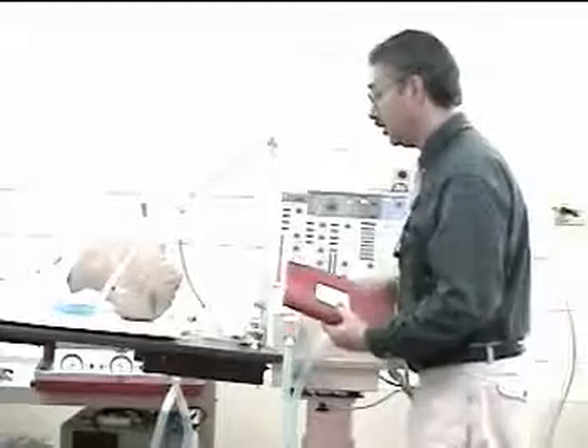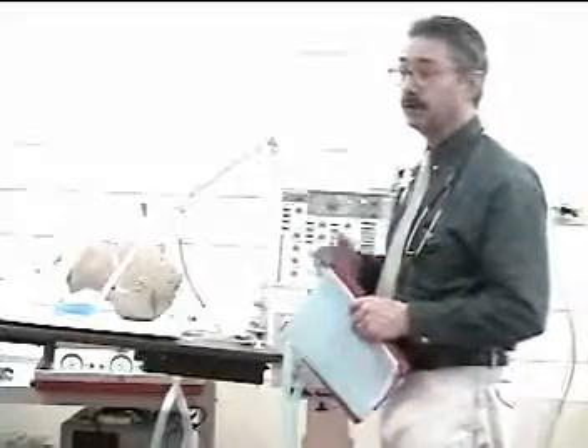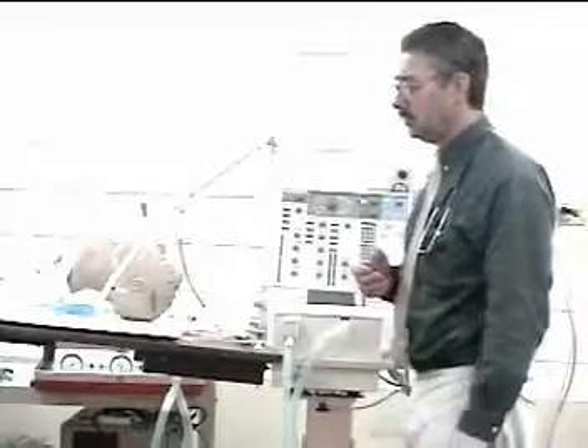At the same time, look at the patient and identify his color and pulse. Check the pulse oximetry monitor and the pulse rate on the ECG monitor. You'll also look at the rate and rhythm of the ECG as well as the level of consciousness — are they responding to your words, looking at you, nodding, or making contact? Or are they comatose?